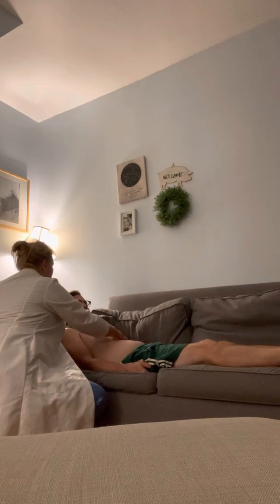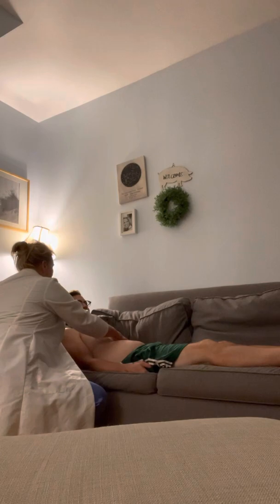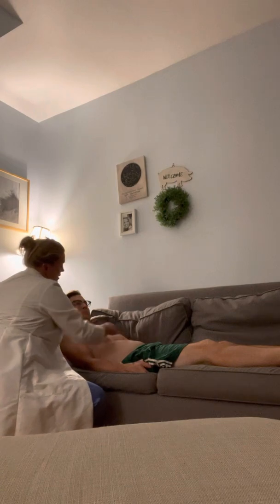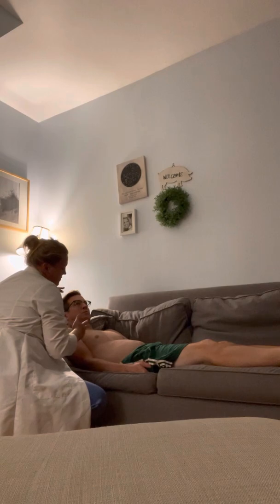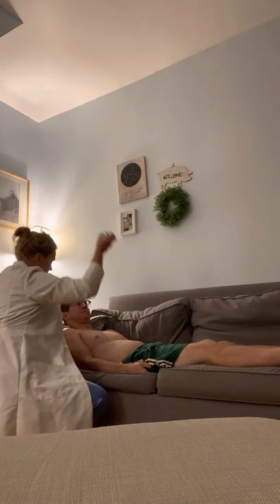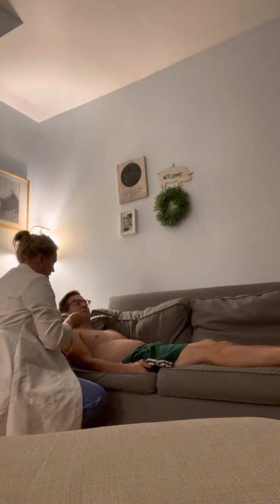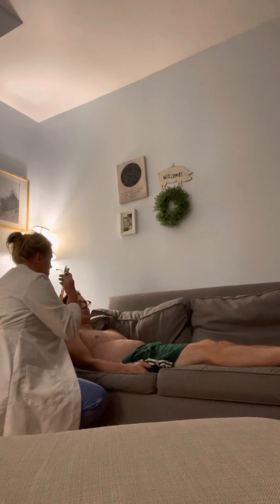While I'm over here, the mitral is also the apex of the heart, and so that's where I've got our point of maximal impulse, which I can feel here very easily. I can't actually see it visually, but I can feel it. And then we're going to auscultate over those same areas, first with the diaphragm of my stethoscope to listen to the heart sounds in those areas, and then we'll switch to the bell to listen for murmurs.